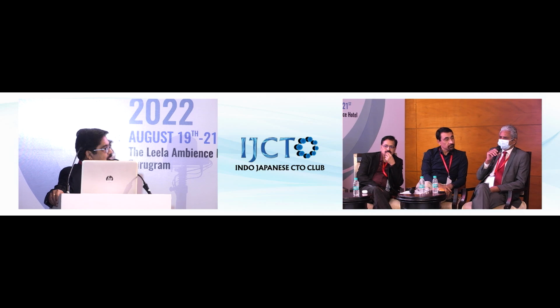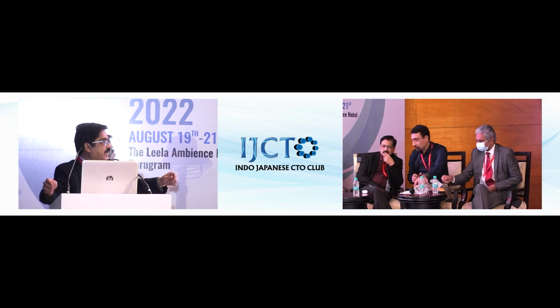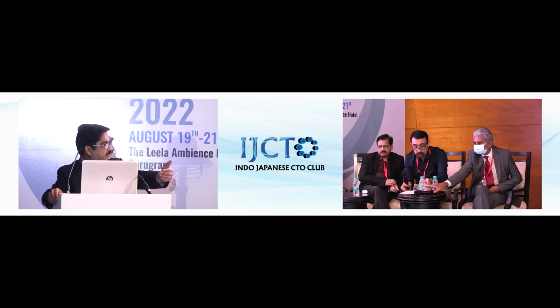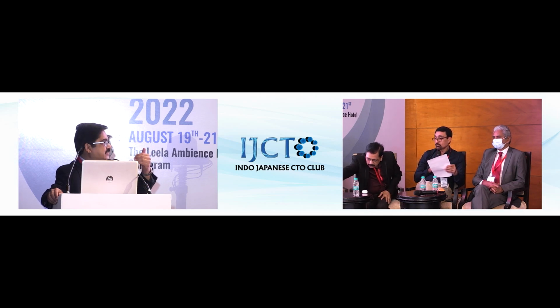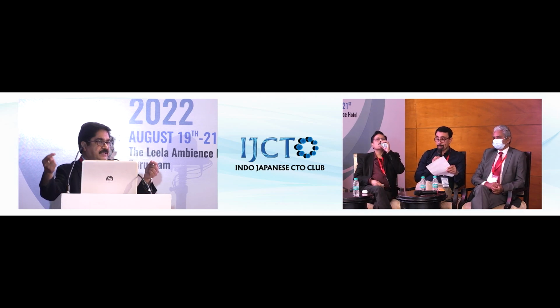In 3D wiring, do you use rotational angiogram? Well, for 3D wiring, if I have biplane, I will see on both sides. If I don't, then I have to move it. It's not a rotational angio, but you see it in the LAO and then you see it in the RAO. Depending on the locations in LAO and RAO, you identify where exactly the wire is placed in space around the artery, and then where the tip is placed. And then depending on that, there are 64 combinations.